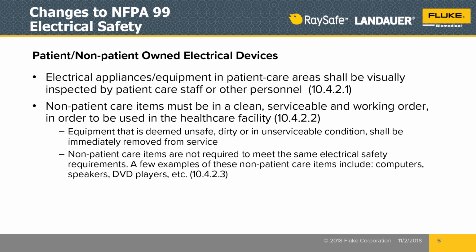It's pretty simple. It's not involving testing or anything else. It's just looking for that unserviceable, dirty, unsafe conditions on an end device. So for the most part, it shouldn't be an issue for day-to-day, but it was worth highlighting that is something that was called out a little bit more clearly starting in 2012.